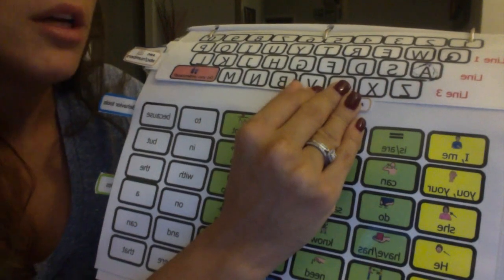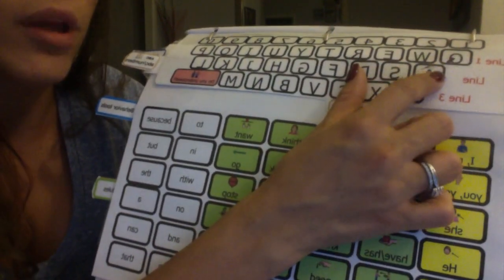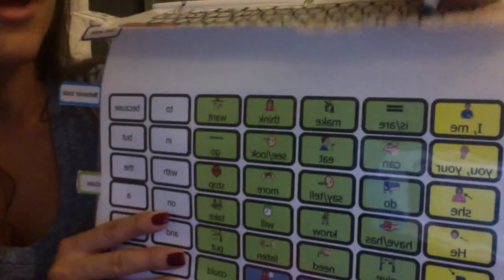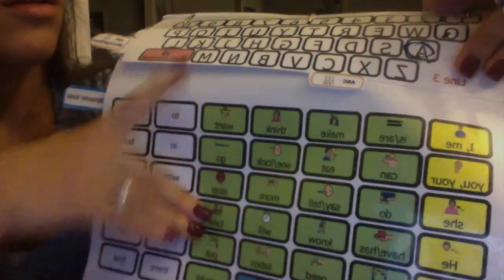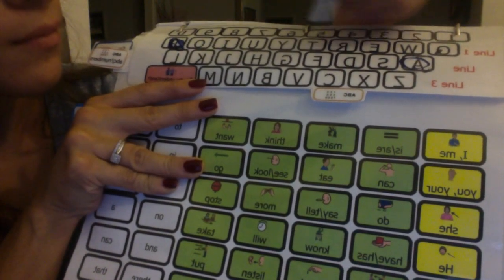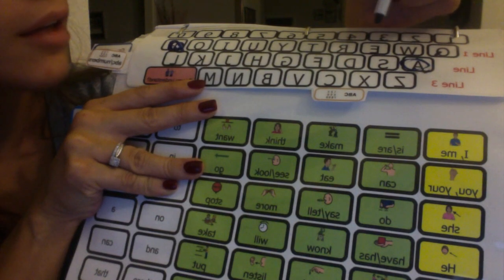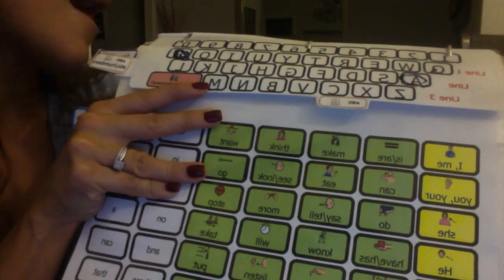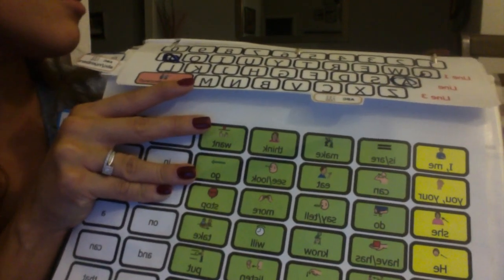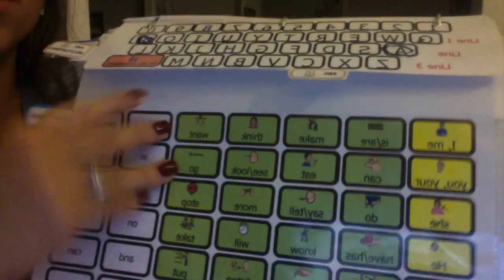ABC and number chart. He could start pointing to the letters to create a new message, or he could just use the dry erase marker to put the message together, such as like A, P, P, and then he could look for L and then E and say, oh, apple, because that's not a word that I have put in the communication book. And he could also put do you understand, to make sure that his communication partner is understanding what he's saying.